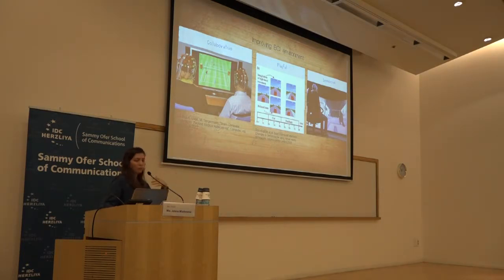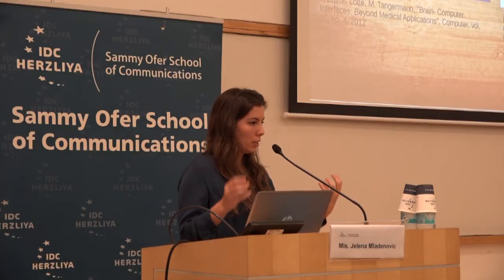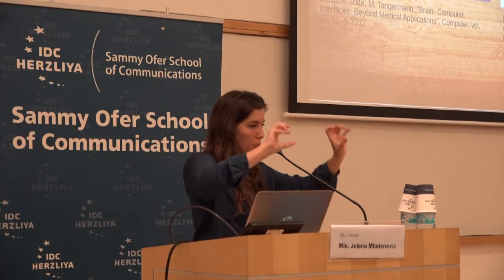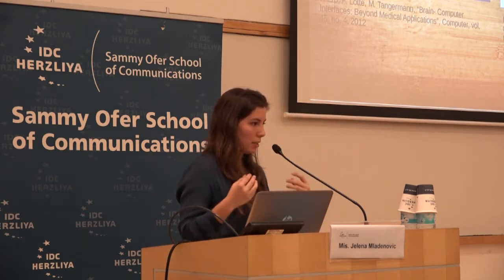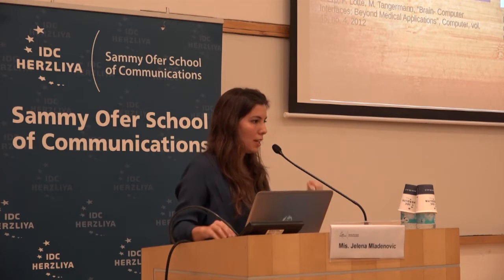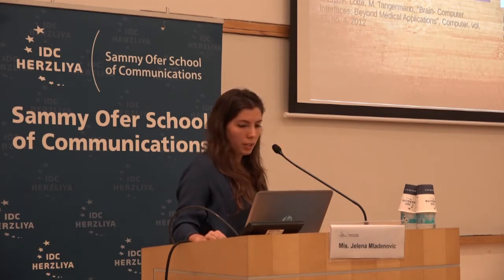So there have been many attempts to create more collaborative, playful, immersive BCI environments, and they have indeed shown that the performance has increased. Also, to give you an example for a P300 speller, instead of using the simple flashing, they would flash different groups of letters, not columns or rows, and they would present smiley faces because humans react to faces. And again, the performance was much more increased. Okay.